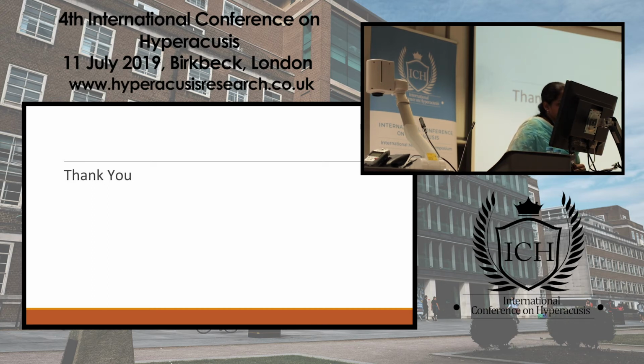Yeah, I still find it puzzling. I think there might have been something wrong with the measurement of the OAEs, because if thresholds are normal and ABRs are normal, then the OAEs should be normal too. Sure, but maybe some middle ear dysfunction. Yes, maybe. The child possibly had some sort of middle ear effusion, because they couldn't do tympanometry. But that would affect the ABRs as well, if you've got a conductive hearing loss.